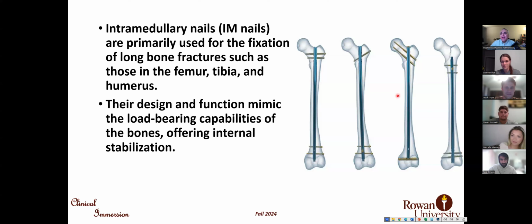He just left. As the name shows, intramedullary nail is a rod that is inserted inside the medulla of long bones. The most common bones that are fixed with intramedullary nailing are femur, tibia, and humerus, but femur and tibia are much more commonly fixed with intramedullary nailing than humerus.